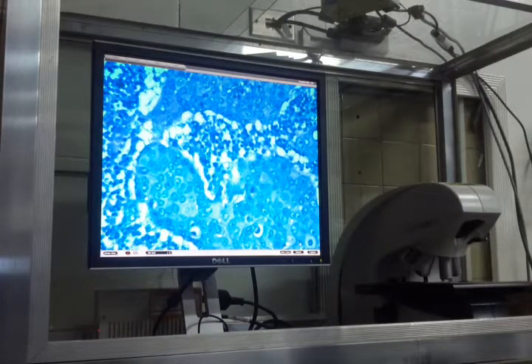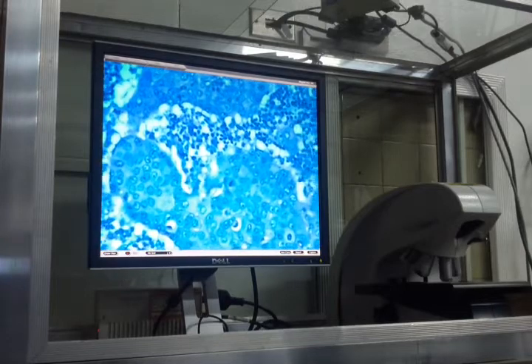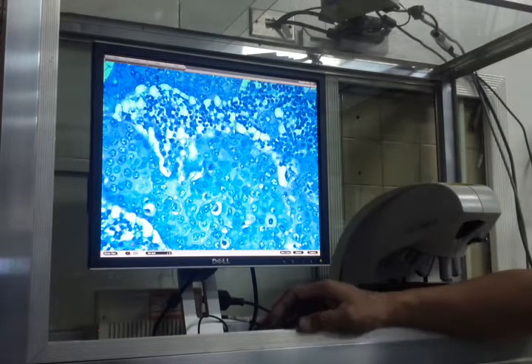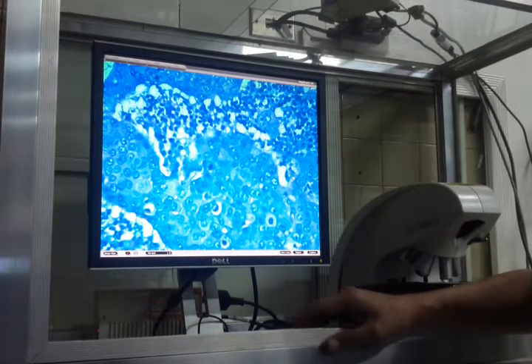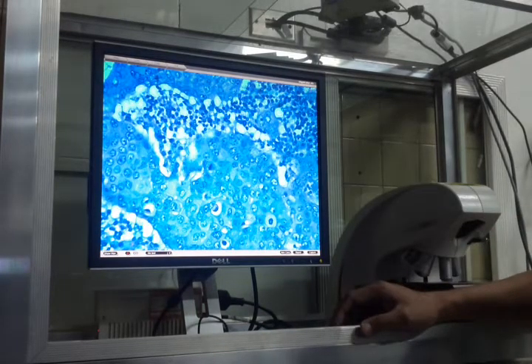What are these? May mitosis ka pa. What are these? These are apoptotic cells. This is an abnormal mitotic figure. Apoptotic cell, apoptotic cell. Abnormal mitotic figure, lymphocyte. What are these? Mesenchymal cell or epithelial cell? Mesenchymal, mamimili na naman tayo.